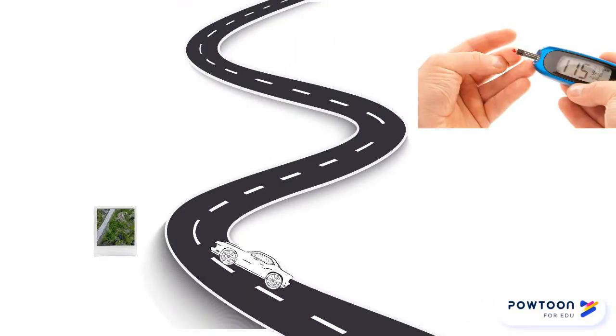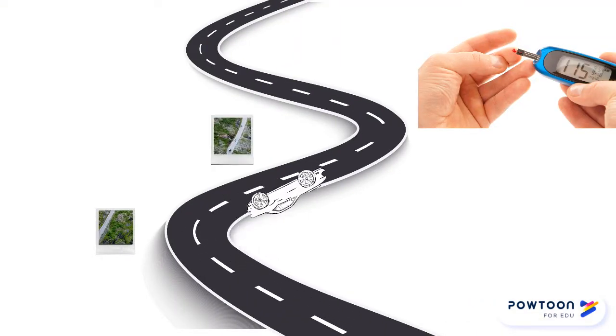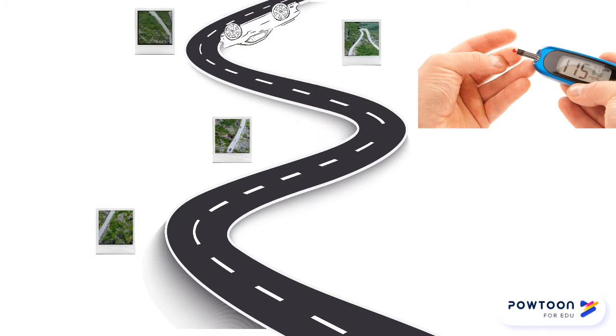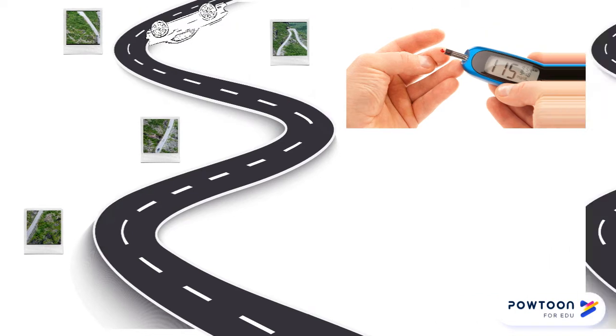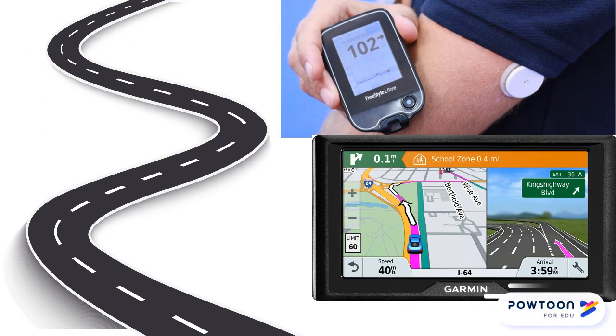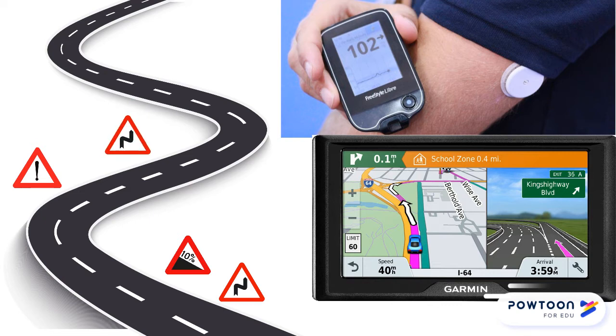Using a blood glucose meter is like driving your car based on snapshot views back of the road, for which you have to stop your ride, look back and see a few meters along the way. On the other hand, with glucose sensors, the driver has constantly updated detailed navigational information about the road ahead, including warnings about hazards and other events, and advice about current speed and driving direction. Thus, without stopping your car, you can follow the past journey with all the ups and downs.